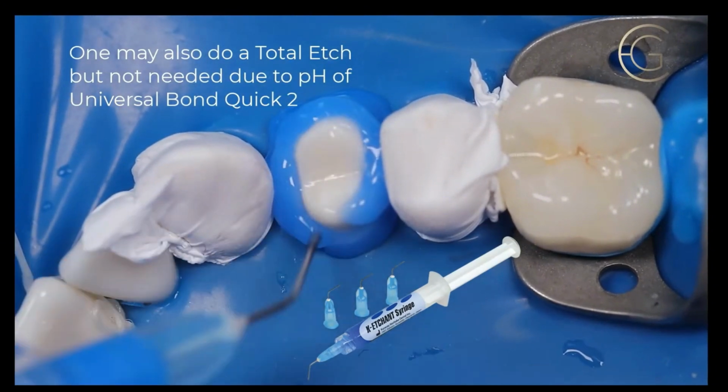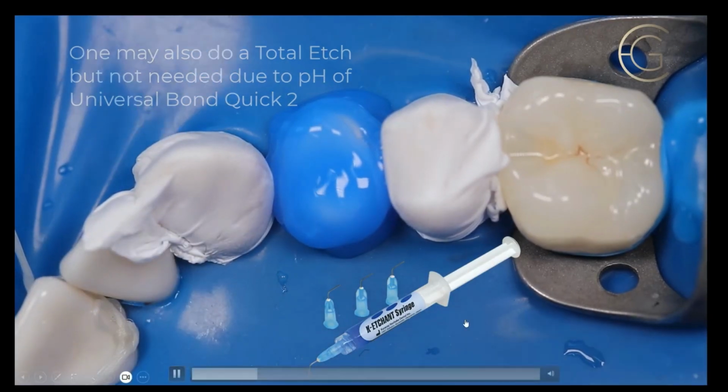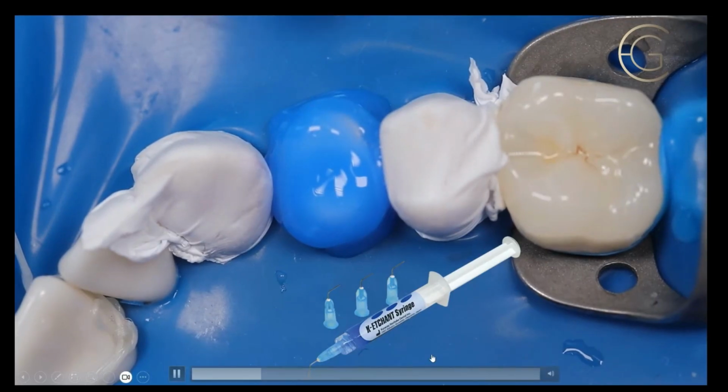But I'm a creature of habit, and I do this. And this cleans as well. This acts as a great cleaner of the resin. Does that make sense? All right, so we're almost done here.